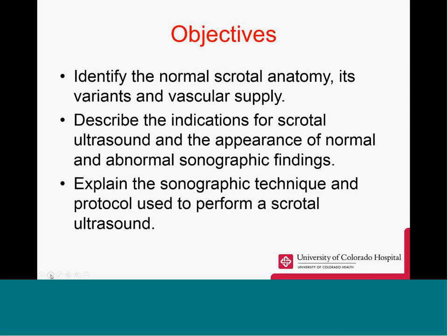We have several objectives today. We're going to first identify the normal scrotal anatomy, its variants and vascular supply. I'm going to describe the indications for scrotal ultrasound, the appearance of normal and abnormal sonographic findings, and then we're going to explain the sonographic technique and protocol used to perform a scrotal ultrasound.